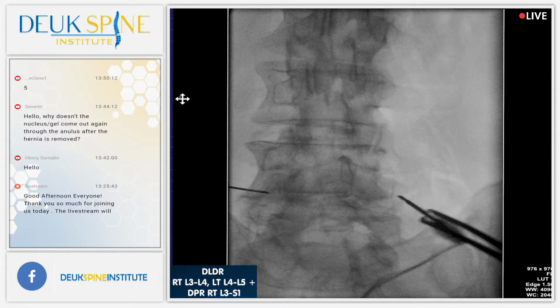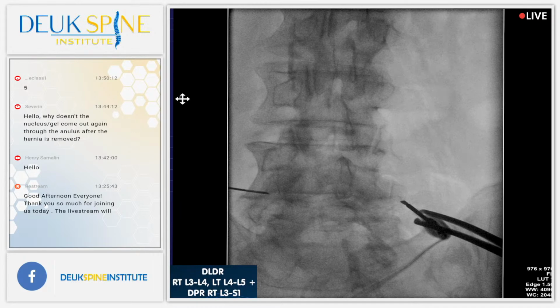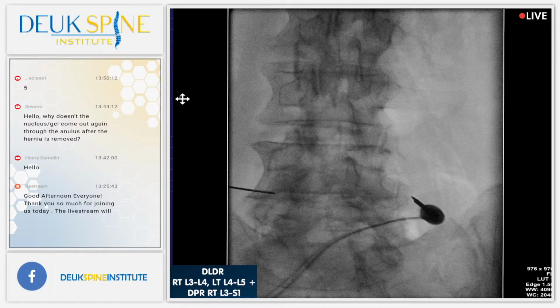All right. Again, this patient has abnormal transverse processes. Sean, let's see where that is. Look at that thing. It's so abnormal. It's like he was born with abnormal transverse processes. Real skinny, not formed normally. They are not normal, so it makes this harder to do, because you have smaller targets.